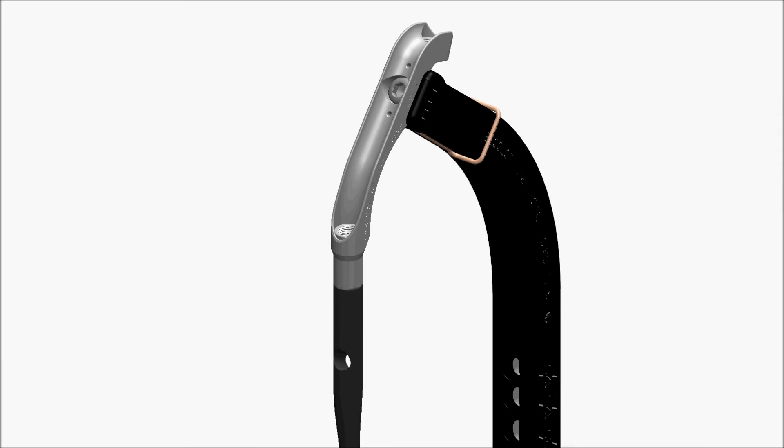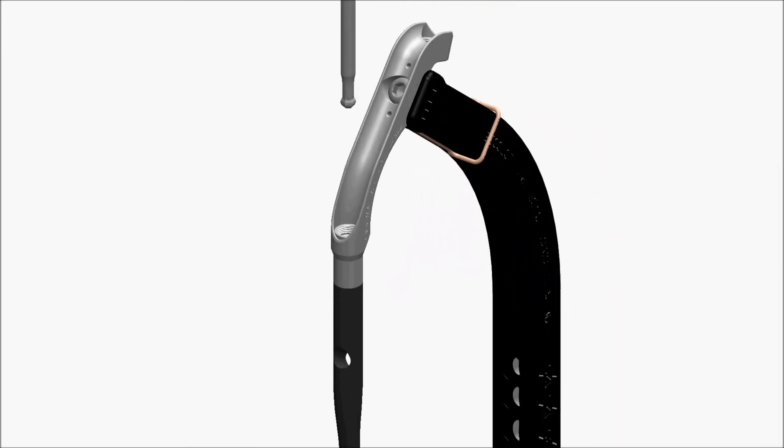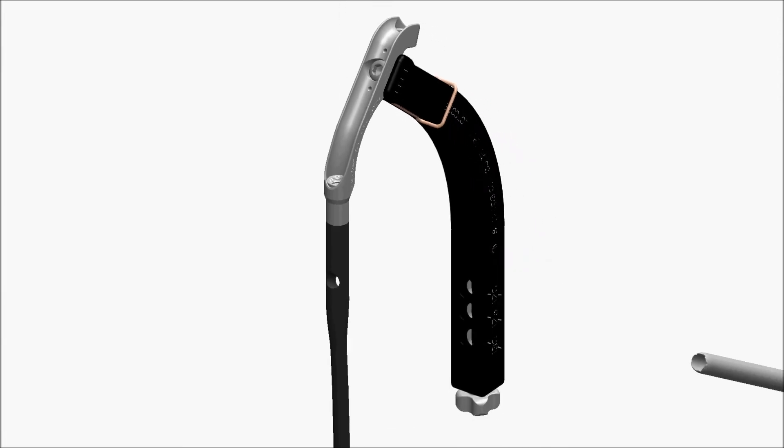Mate the chosen nail to the guide arm by lining up the laser references. This screw should also be securely tightened. Confirm that the targeting arm lines up with the hole in the nail.